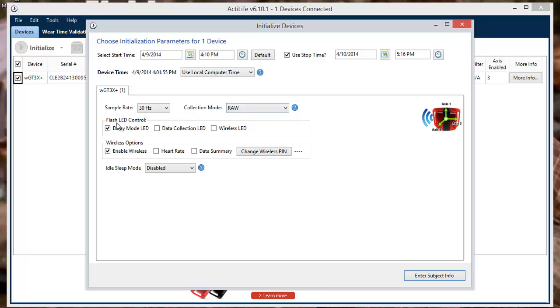The LED light located on your device can be controlled in the Flash LED control box. Your options include Delayed Mode LED, which will allow your light to flash from initialization to start time, and Data Collection LED, which will allow your light to flash from start time to stop time, or when the device is downloaded if a stop time wasn't selected.